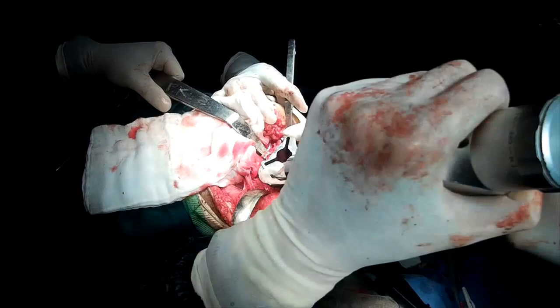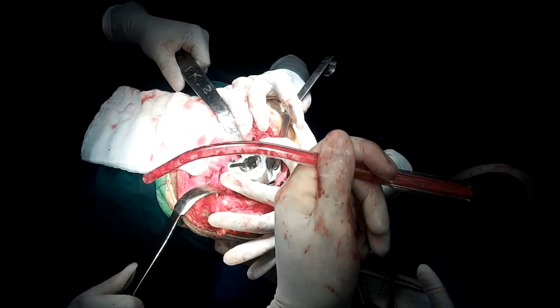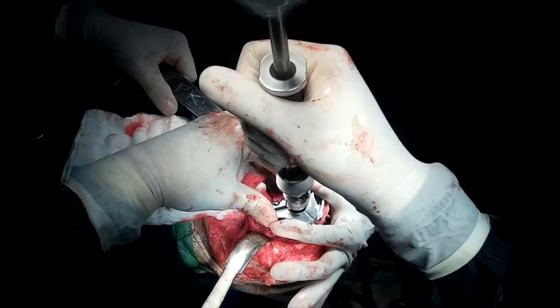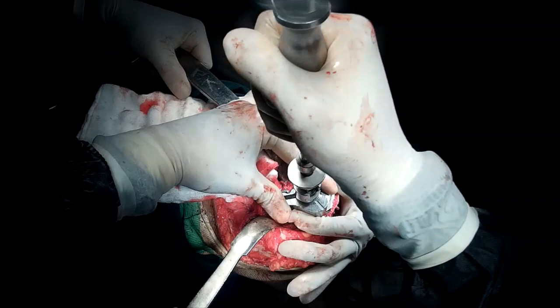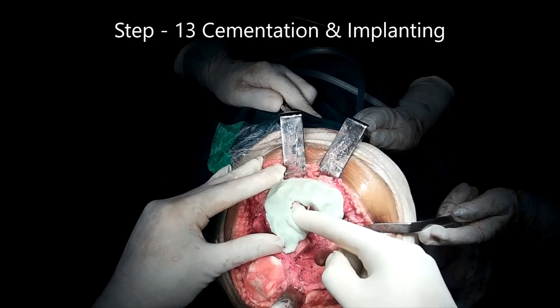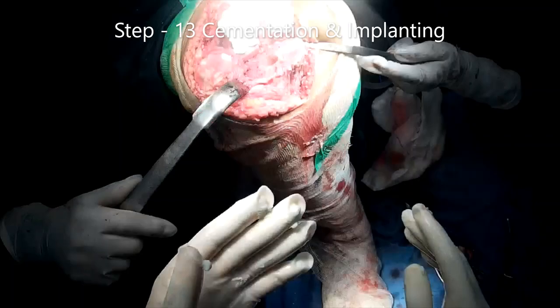Tibial broach housing is placed over the tibial base plate. Proximal tibia reaming is done, followed by broaching the tibia with the help of tibial broach. Using standard mixing protocol for bone cement, the implants are implanted after cementation.